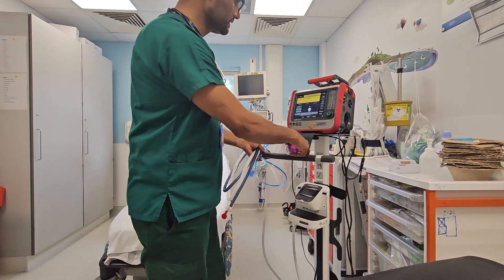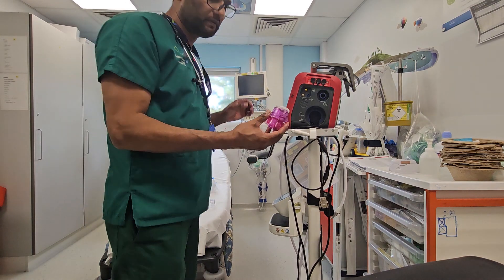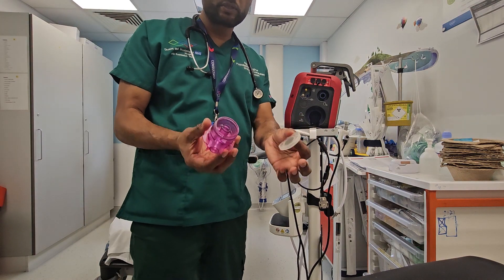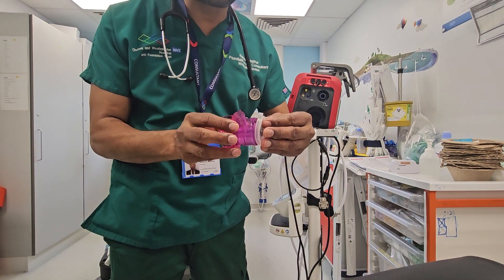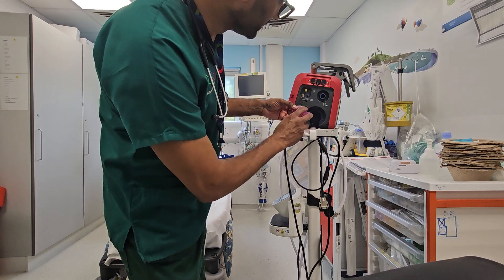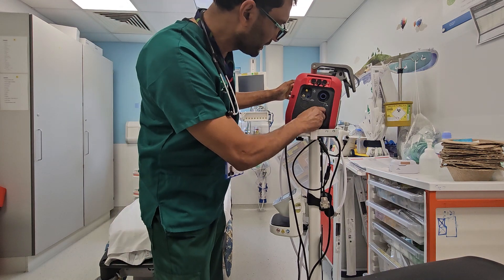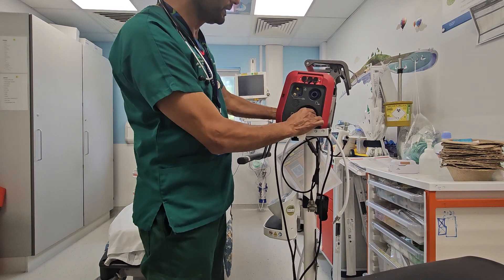So first of all, the circuit comes with a well which very often gets lost. Make sure that this goes on top like that, and then it goes in there and clicks in. Make sure it clicks in properly.